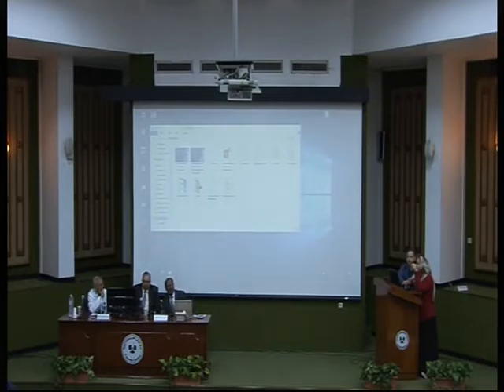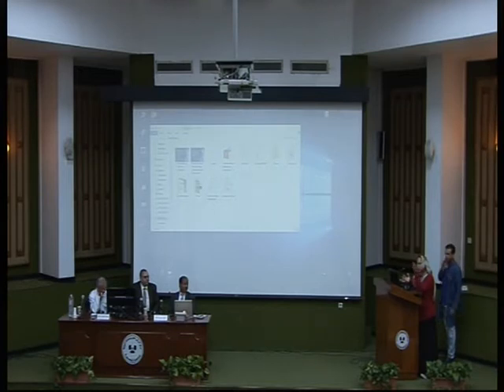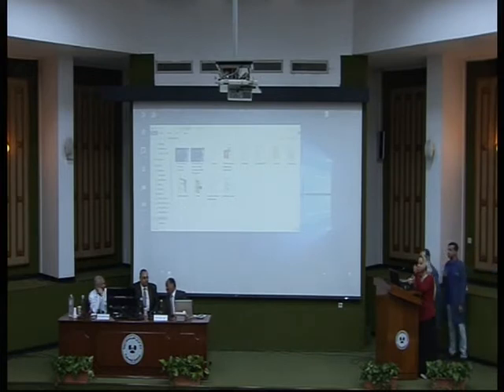The first part of the question, the surface area of the child and the surface area of the filter. We said that we have the ratio divided to be equal to one. We don't want to put a large filter like we use in adults in a small child and expose him to high complications. So I will choose the appropriate size of the filter. Every filter has a rated surface area, and it must match the surface area of the child. So you should calculate the surface area of your child by one of many equations, and then match the proper surface area, which is written on the filter.